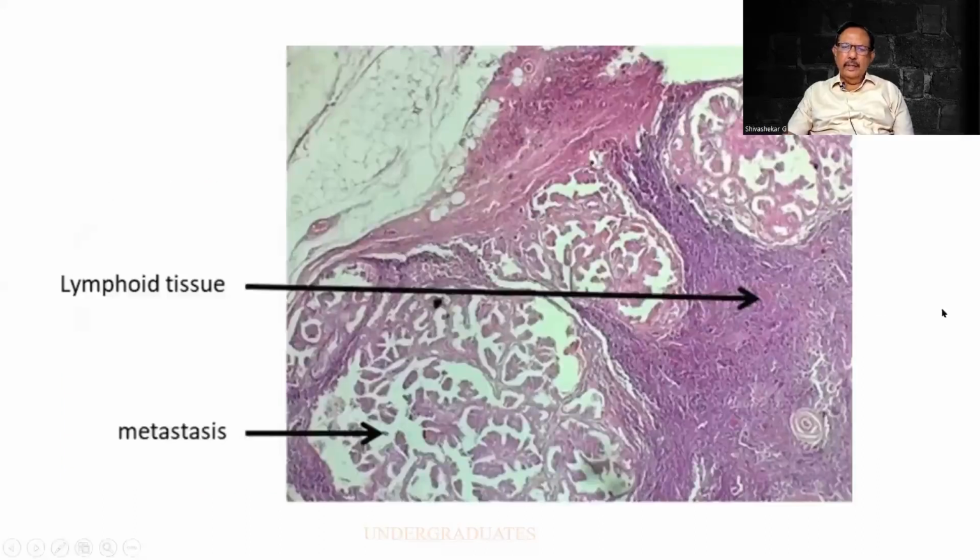This again is important for us. You would have seen a tuberculous lymph node. I am finding this bluish material, not very clear. And this is a capsule, with pericapsular fat. But below the capsule, there are multiple irregular glands that I can make out. So it is a metastasis.